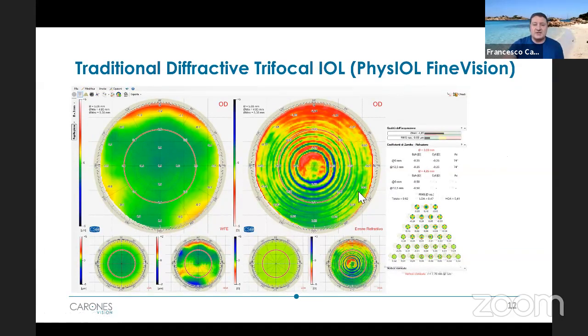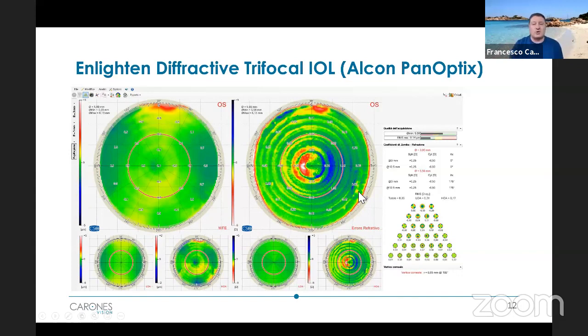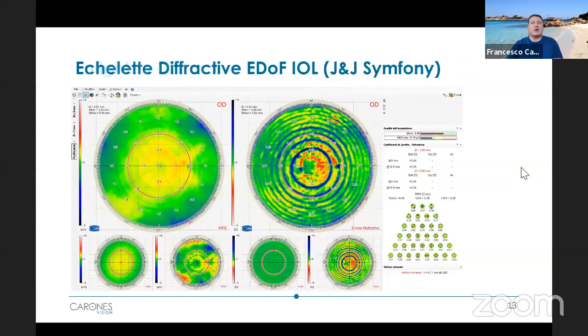And in this case, there's another trifocal made from a quadrifocal project. Again, I think you can really make a distinction between the previous image and this one, where here you can see the fourth focal distance that has been redirected to far. So green, in this case, plano. So the continuous wave is not 1-to-1, is not 2-to-1. In this case, it is a wave, another wave, and then a flat area, a wave, another wave, and a flat area, as is typical from the Panoptix pattern.